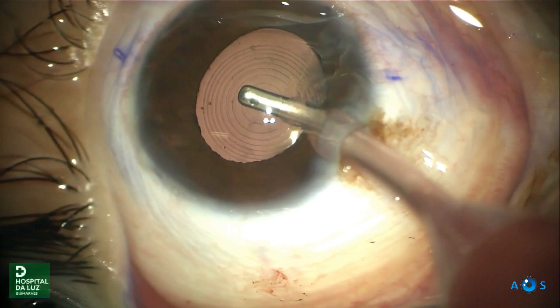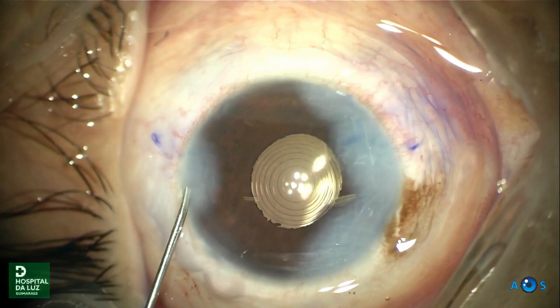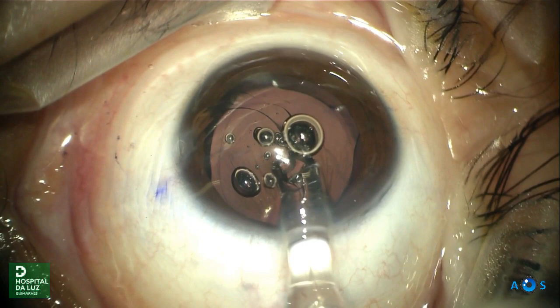We removed the viscoelastic in the anterior chamber, in front and behind the lens, and in the capsular bag, and made sure that there were no remnants of viscoelastic at the end of the surgery. We checked the centration of the lens, injected the intracameral antibiotic, and hydrated the incisions of the cornea. The fellow eye surgery was performed in the same way.